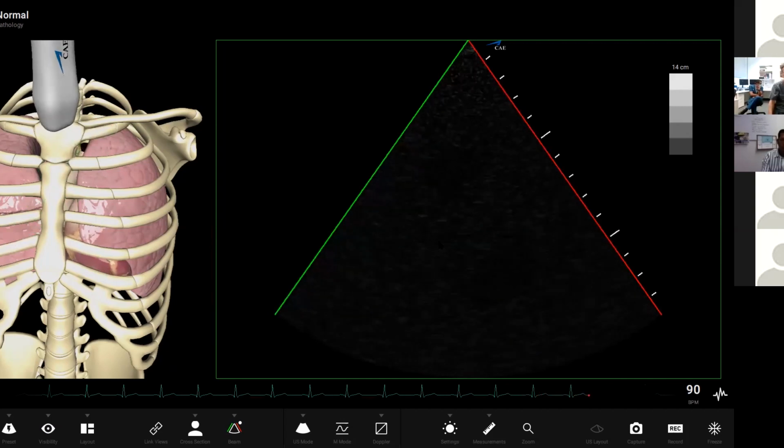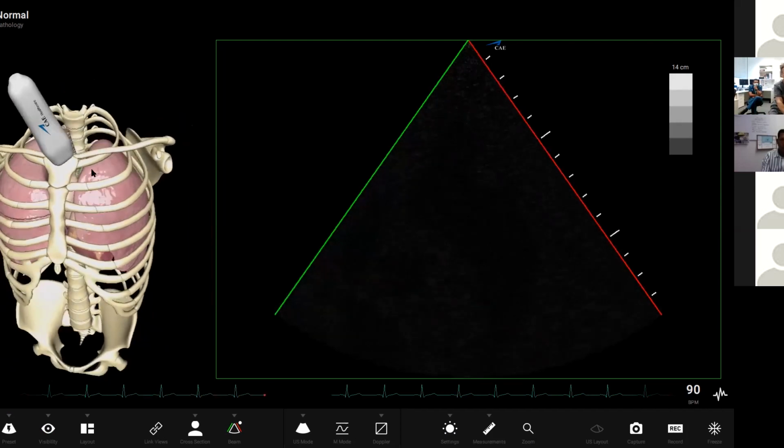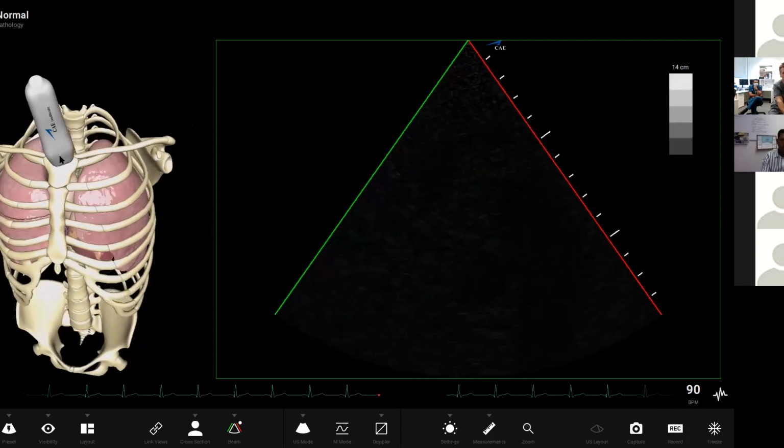And I was going to say the other one is obviously to look for it, and Bob's not great at this, I'm afraid. It is going in right from above the sternum, coming down and looking into it. As I say, Bob's not used to showing these views, but that's what you can do, and you'll get the arch for that one.